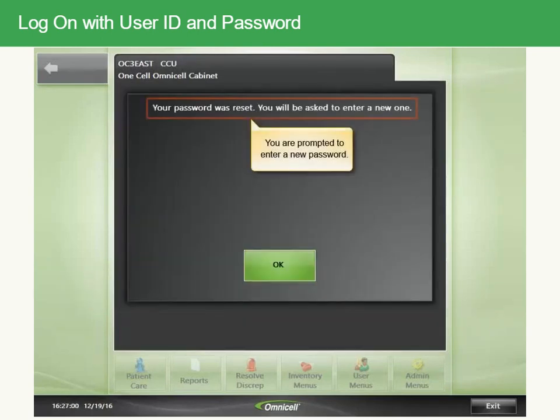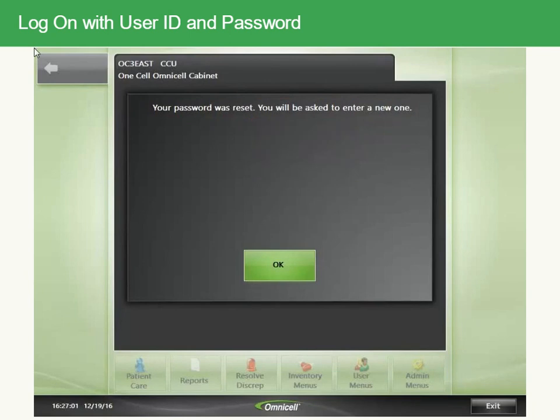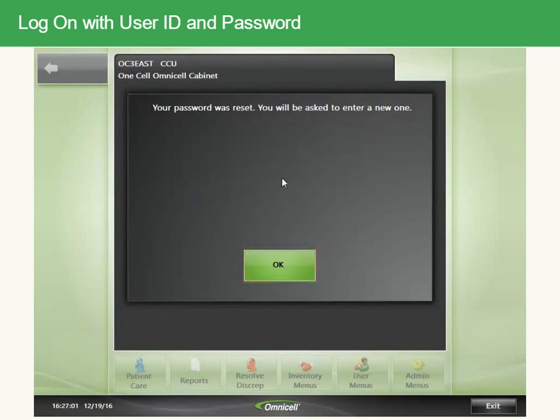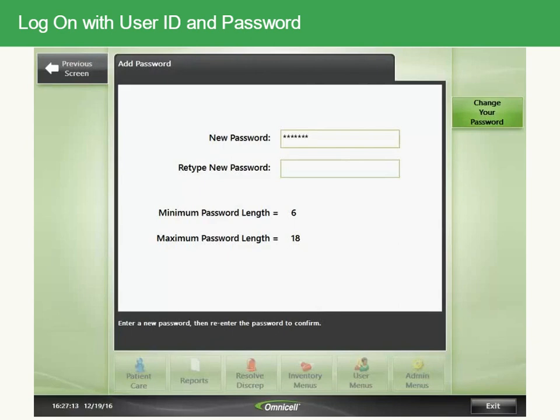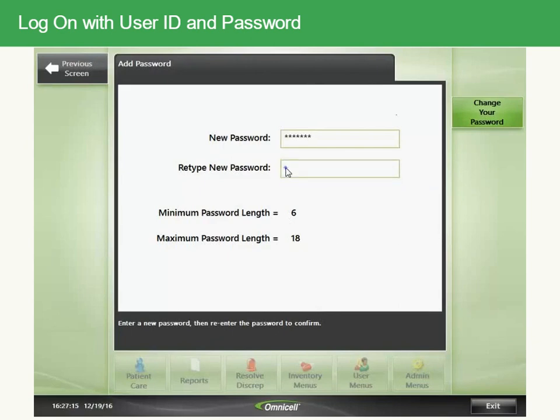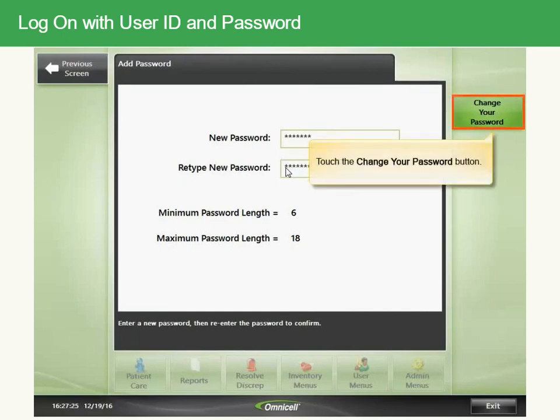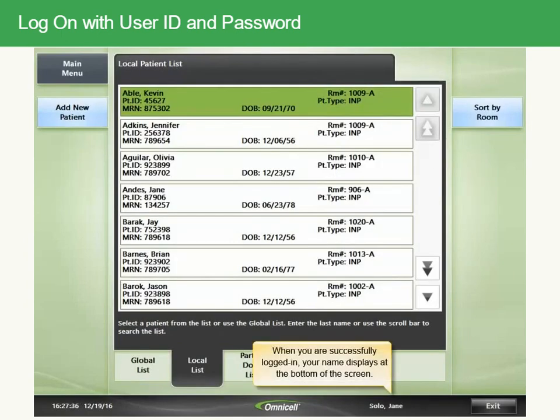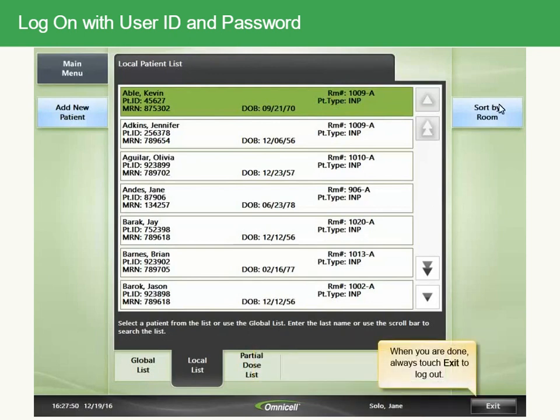You are prompted to enter a new password. Touch OK to confirm. Retype your password, then touch the Change Your Password button. When you are successfully logged in, your name displays at the bottom of the screen. When you are done, always touch Exit to log out.